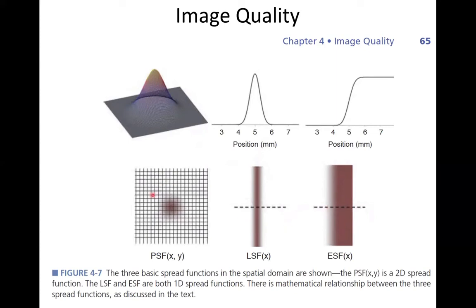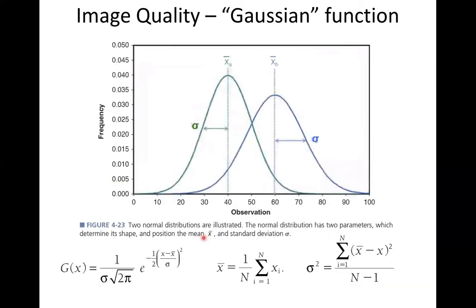Most of what we're going to talk about is the point spread function, and it is the most practical way of telling somebody about an imaging system in the fewest words. It's this spatial resolution. I'm going to pause here and just talk about Gaussian functions. You're grad students, and so you've all used these functions, but let's just review it.